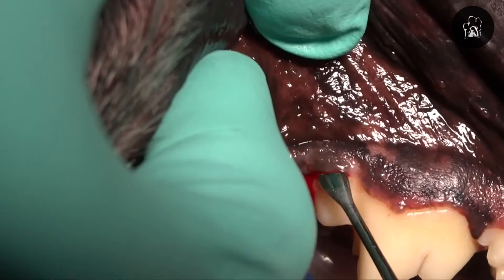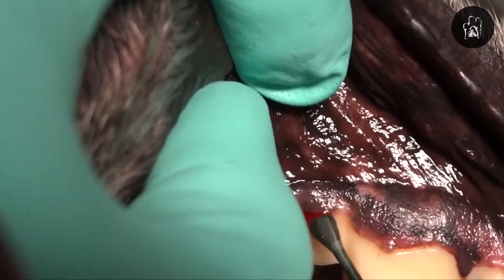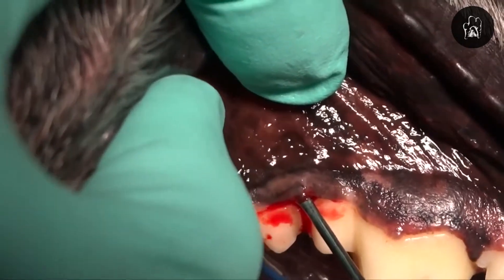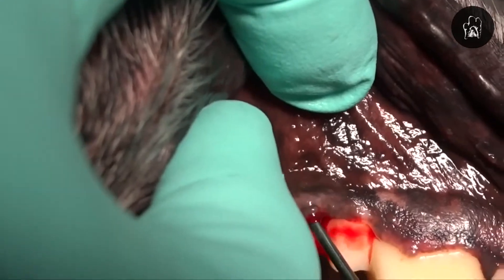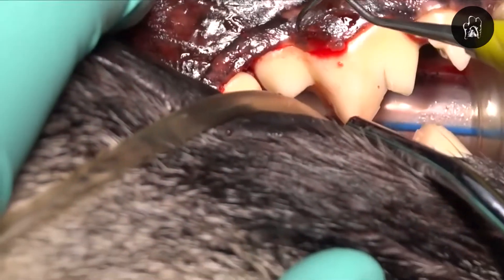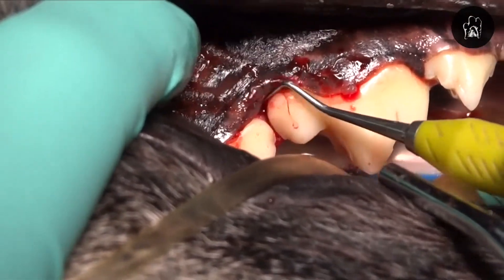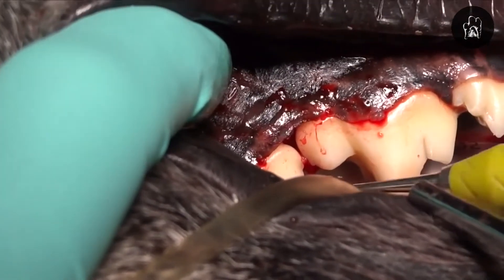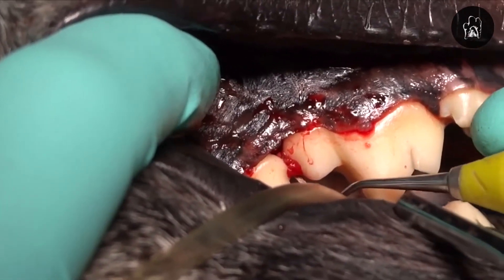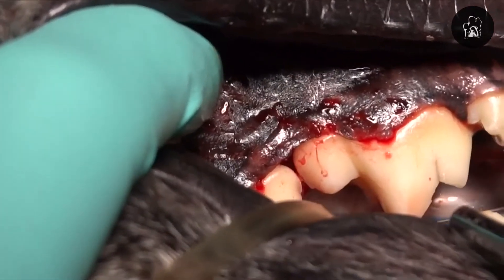And this dog is fairly young — this dog's four. We're using a periosteal elevator to expose that area and then using a periodontal curette to remove that granulation tissue. And you can see that right there on the tip of that instrument where we've scraped that out of that defect, right in the decrease in density area that you saw radiographically.